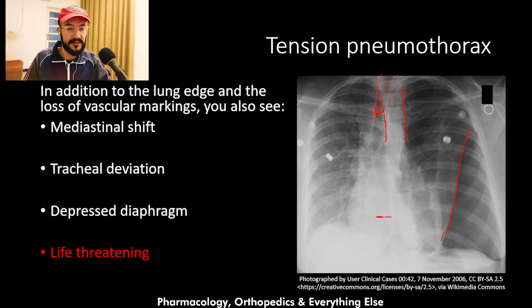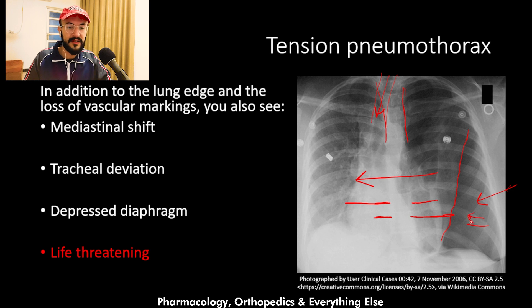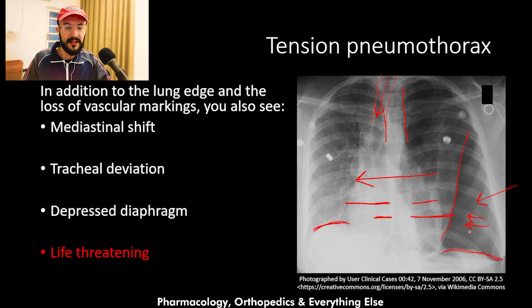Normally one third of the heart is to the right and two thirds are to the left. But in this picture more than two thirds of the heart are to the right, so the heart is shifted to the right side. In tension pneumothorax, air entering the chest cannot leave, so it keeps pushing all organs away, causing mediastinal shift, tracheal shift, and a depressed diaphragm. The left diaphragm here is quite depressed compared to the elevated right diaphragm, because the air is pushing the diaphragm down.